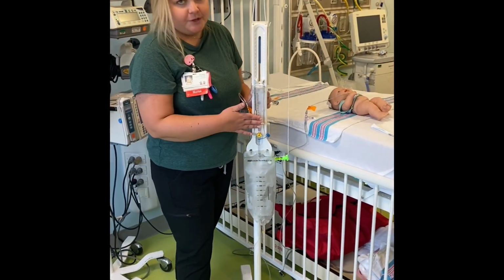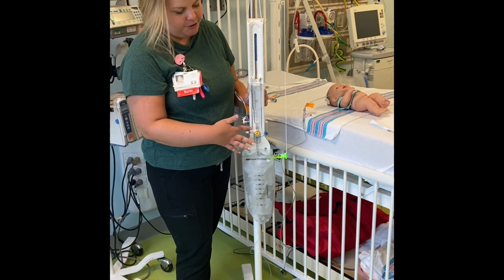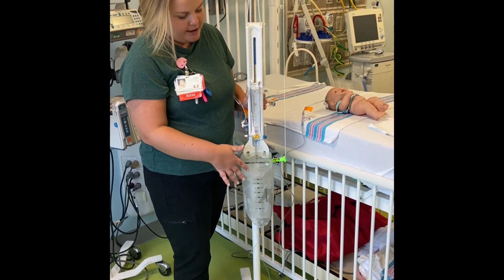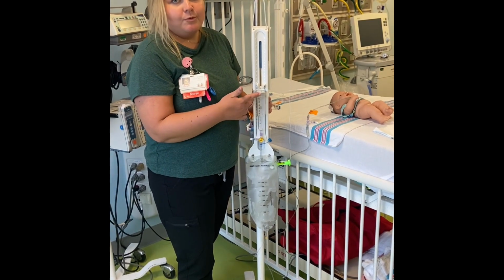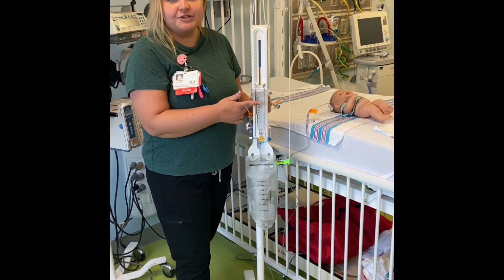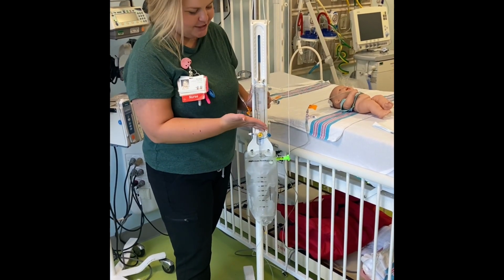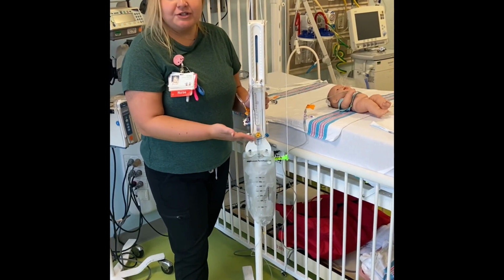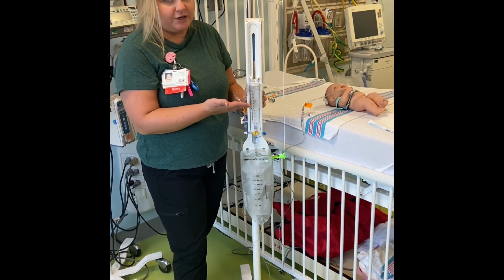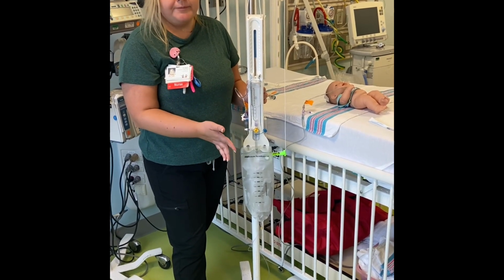One thing to note with your buretrol is when you are traveling, you always want to make sure that you're emptying your buretrol before you travel. If fluid in here touches the filter up at the top, it will make your EVD stop working within the next 24 hours, and then you get to call neurosurgery and tell them that their EVD no longer works. So we obviously want to avoid that. So just always make sure that you're emptying it before you travel, or if you have a lot of CSF in your buretrol, just go ahead and empty it as well.